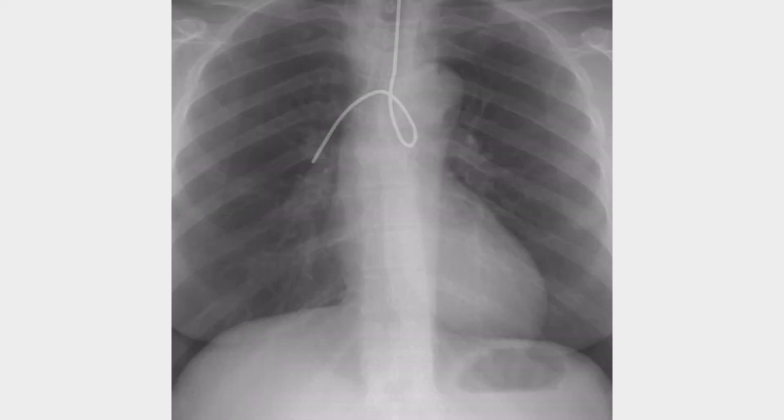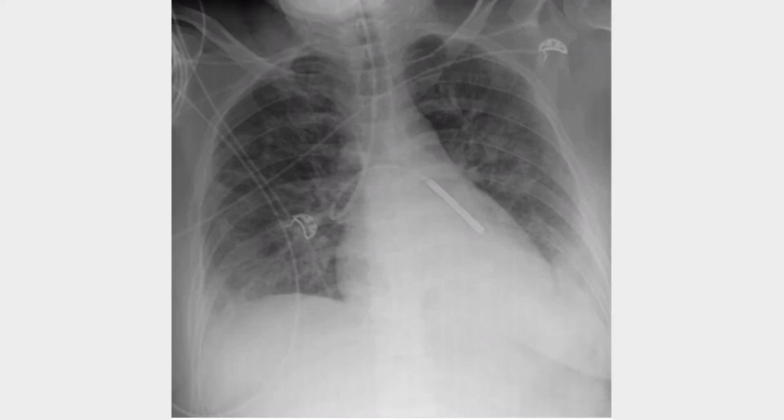Here is another X-ray. This is an NG or OG tube — we don't know — and as you can see, it's coiling at the carina and then going into the right mainstem bronchus. It's not crossing the carina in the middle and it's not crossing the diaphragm. This should be removed immediately.